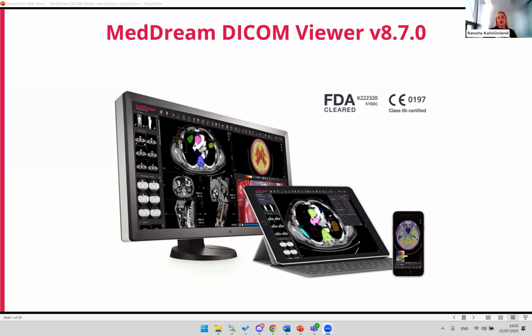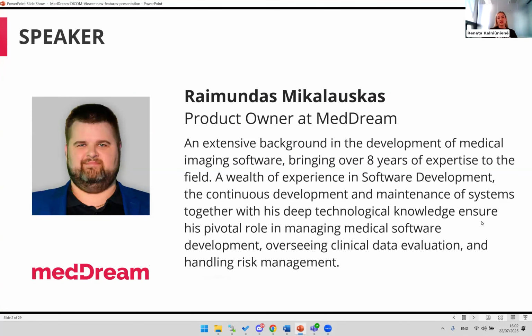And as you know, today we have a webinar dedicated to our new release of MedDream and its new features. And also I want to present our product owner at MedDream, Raimundas Mikalauskas. He is responsible for the development part of MedDream, and today he's our main speaker, the presenter of new features, the most important updates and enhancements of MedDream, and of course news.